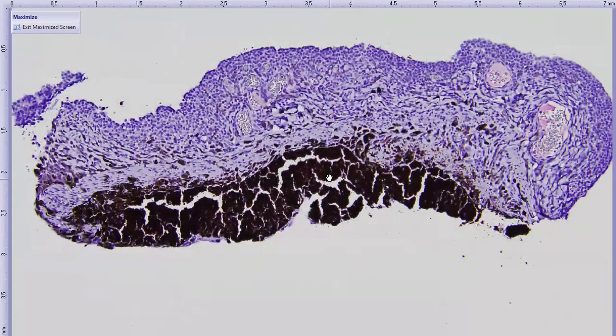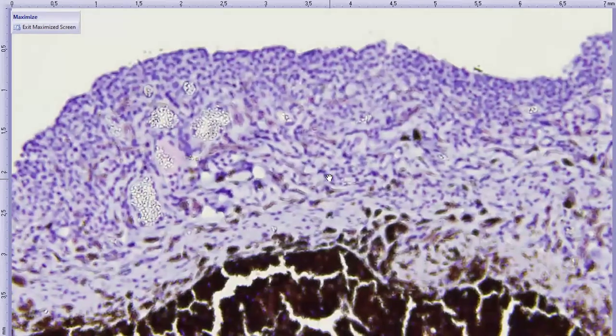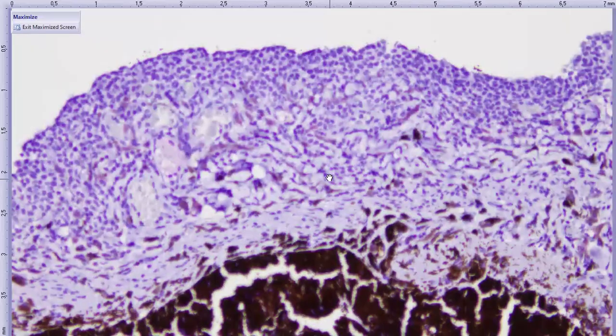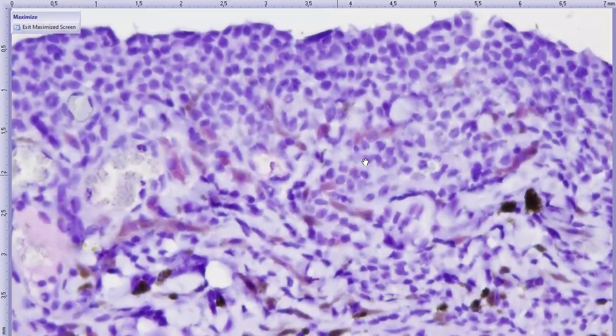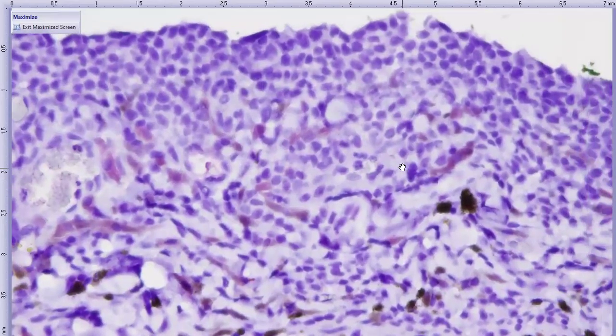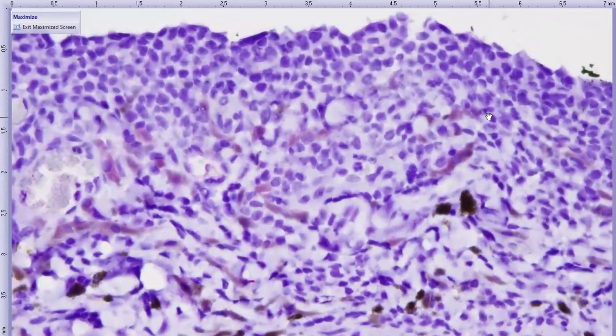It's a little less of a problem with cats because they have few melanocytes and it's a little bit lighter staining. So it's maybe not the best red chromogen representation, but we can still see some of the positive cells. The cells that probably had those faint blush of pigment in the cytoplasm are staining positive here, but a majority of our population here is negative staining. So heading down the lymphoma track.